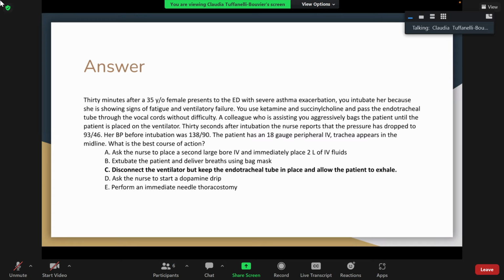So when you have a patient on the ventilator, you're constantly going through, making sure that everything's good and their vital signs are fine. If not, you're checking those things, going through what we talked about. But along with what you said, at the same time, you could easily do 1 liter of fluids. Most asthmatics getting intubated are on sedation. Fluids probably not going to hurt that patient either.